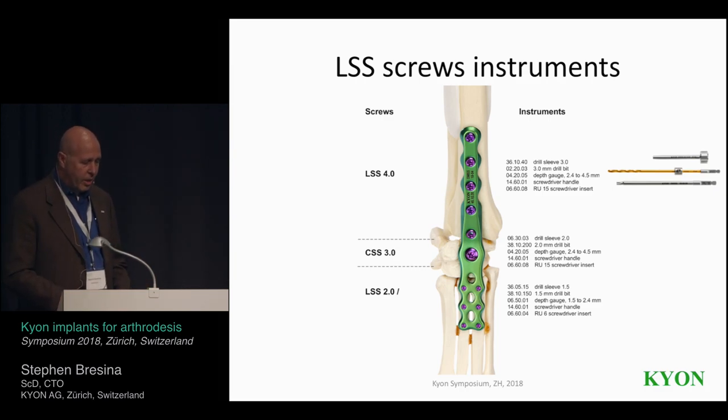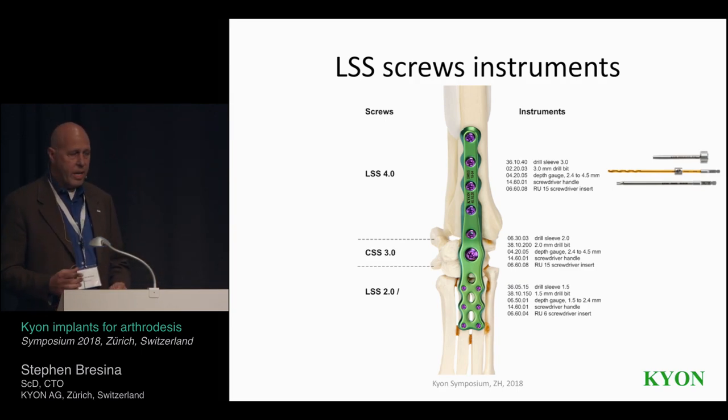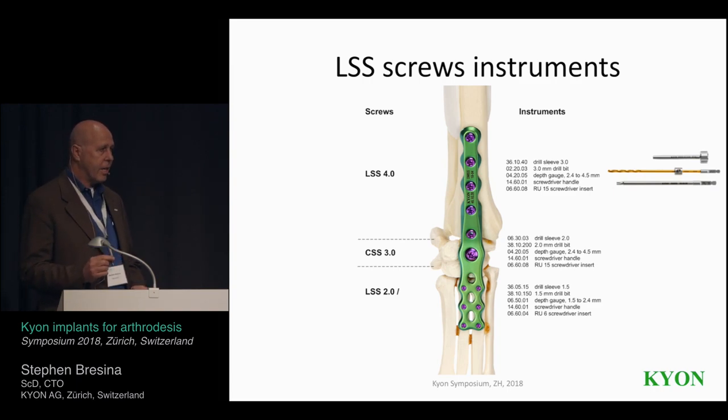And another reason we decided to go with ALPS 2 is that we wanted to use titanium alloy for the strength. And the KYON standard now is that the original ALPS that are a pure titanium are the light blue anodized color. The green anodized plates are the titanium alloy. So we wanted to keep a titanium alloy, high strength. And since TPLO and DPO already had the conical screws and the alloy material, we wanted to keep with the standard that we've set up now, that these would be green plates that have the conical locking, so they were going to be the new style of what we'll call ALPS 2 plates and holes.